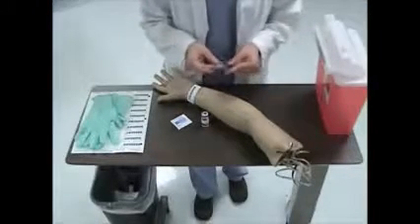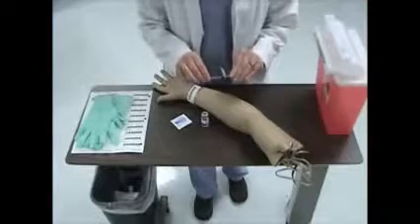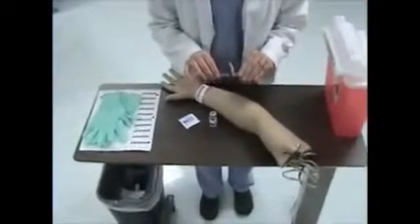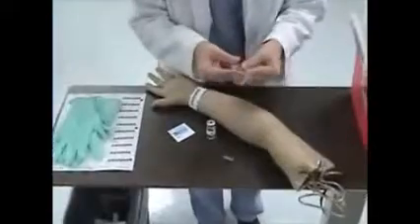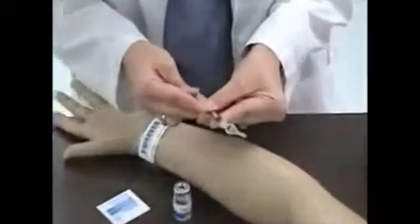Next, I'm going to draw up my PPD solution. The dose for PPD is always 0.1 mLs. I'm going to begin by removing my cap. I'm going to pull the plunger back to the 0.1 on the syringe.